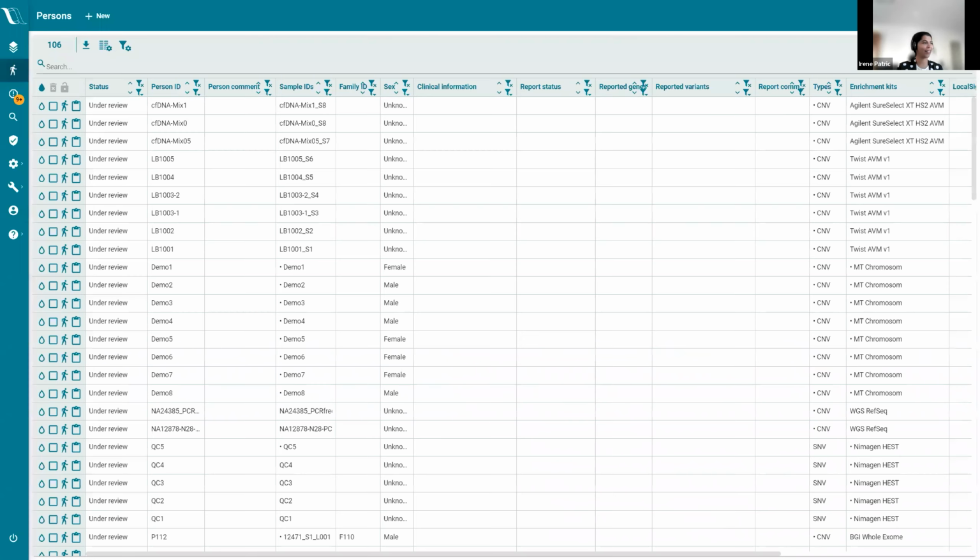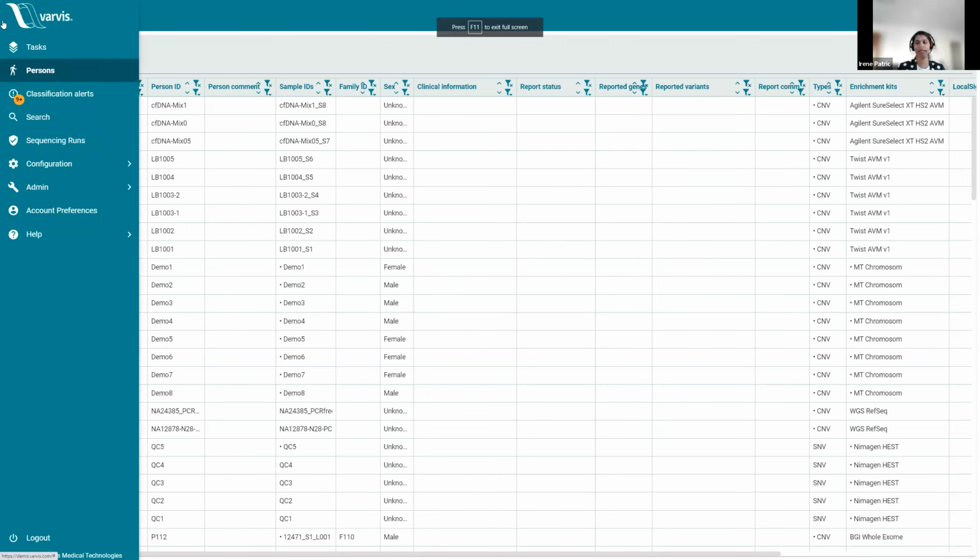Like Yvonne said, I will quickly take you through varvis. I will show you a few cases that I've prepared so that you are able to understand how the tool works, and I will also give you an overview of the structure of the tool. So let's start. And now this is the varvis user interface that the users normally work with.